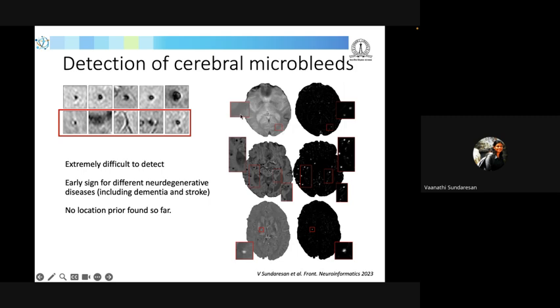So these are the two dots. I have shown the magnified images here. Similarly, there are dots here for the SWI modality, and you see that they are extremely small. If you see these two rows, the top row shows the actual microbleed lesions, whereas the bottom row shows the mimics, structures that occur in the brain. They have characteristics very close to microbleeds, but they are not microbleeds. So they mimic the microbleed. For instance, this is a penetrating blood vessel.